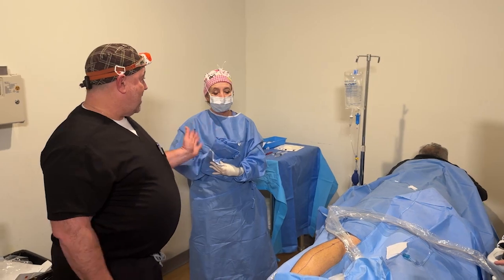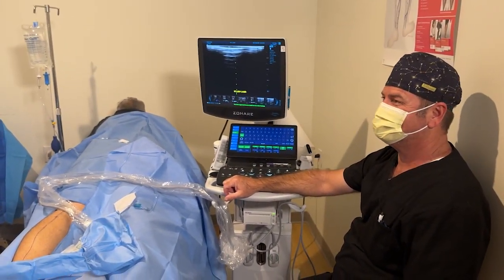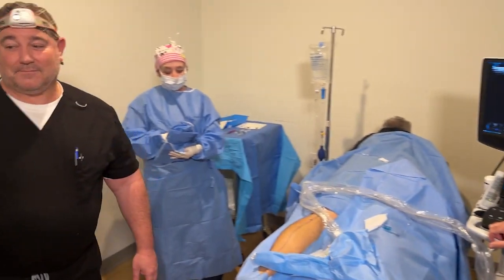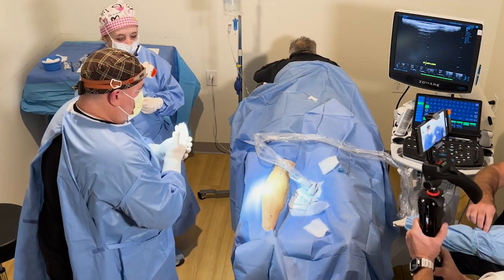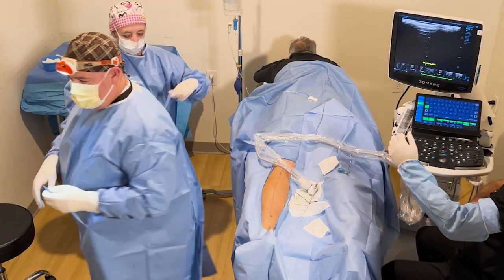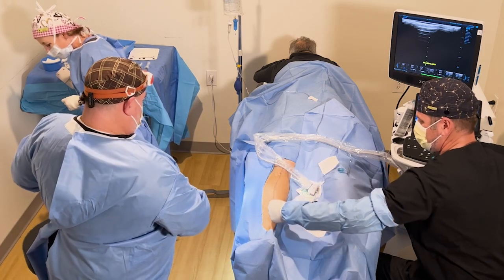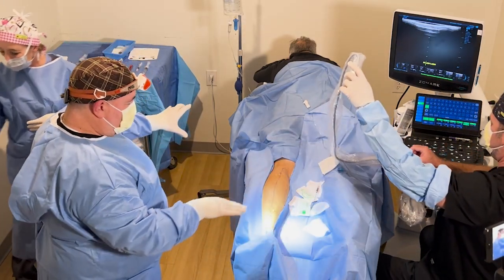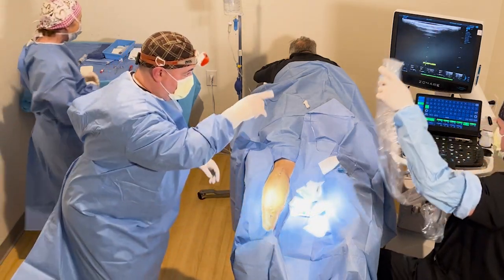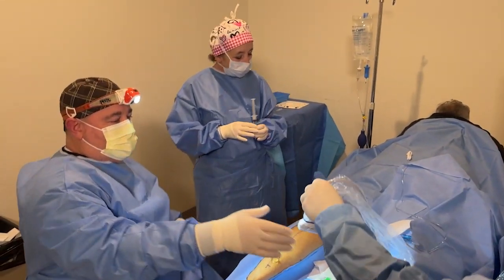Today we have Tammy, our surgical technologist, and Scott, our ultrasound technologist, and we're ready to go. We try to do this procedure as sterile as we can, given that we're not in an official operating room but in the office. Everything blue is sterile, including Scott's arm there and the ultrasound probe.